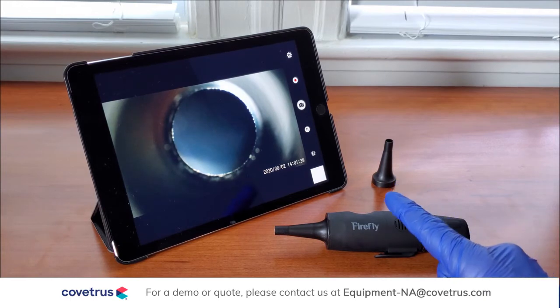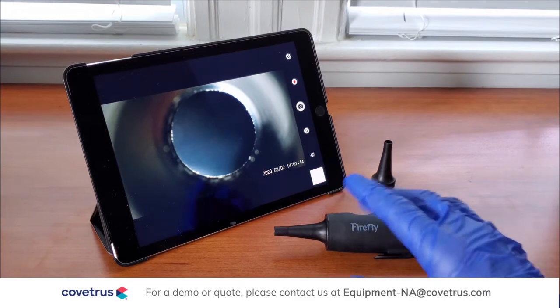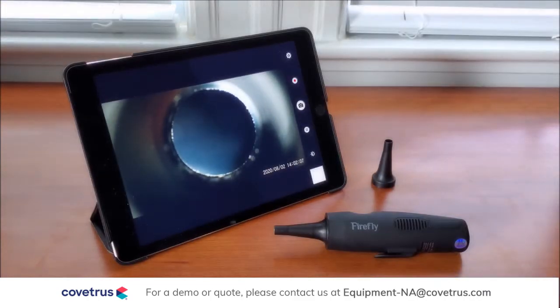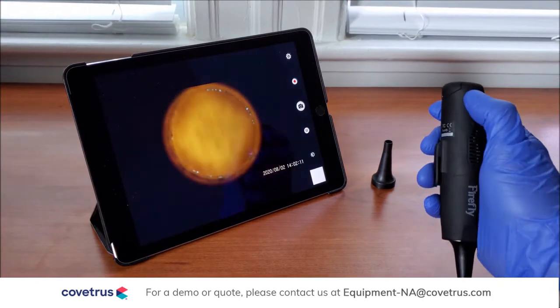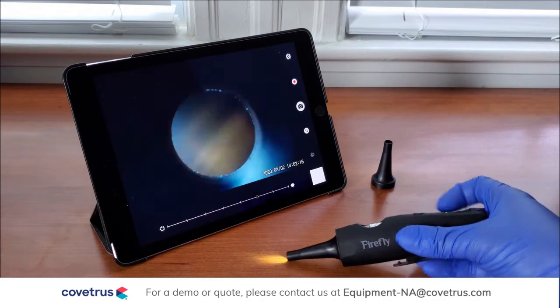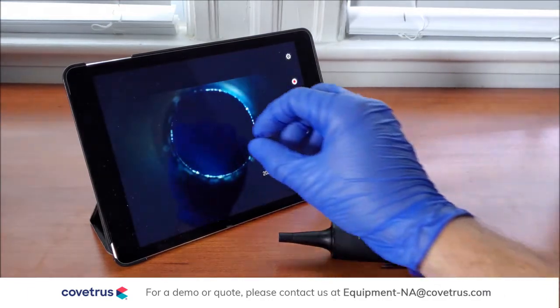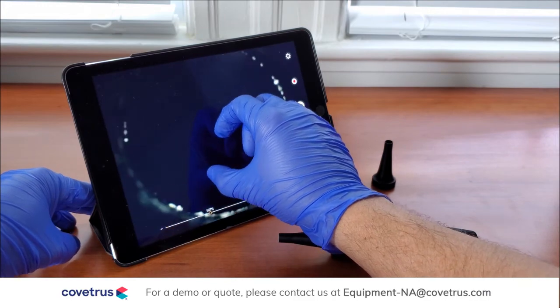All images and videos taken with the otoscope are sent to your mobile device and are stored as standard image files. Other features of the otoscope include brightness that can be controlled on the device, or pinch zoom that can be used on the screen.